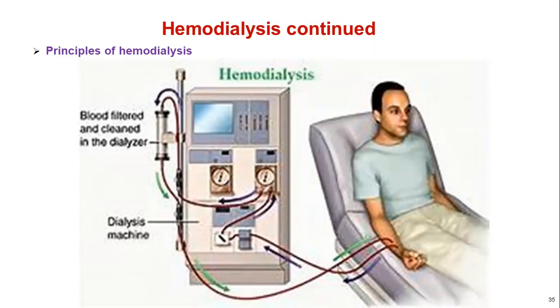So before starting hemodialysis, what you should do during the process, what you should do after the process, and also what you should educate your patient. This is the area we are going to focus on right now.